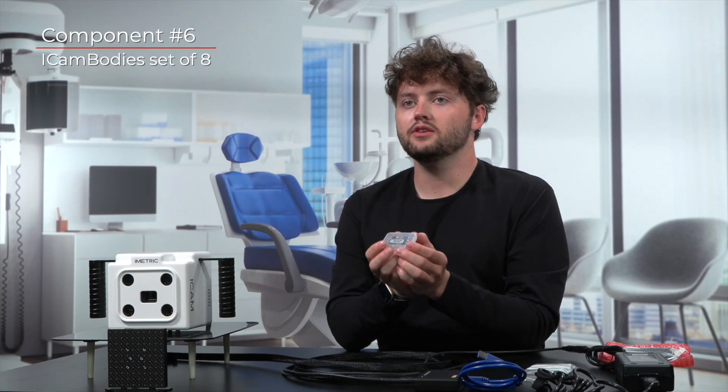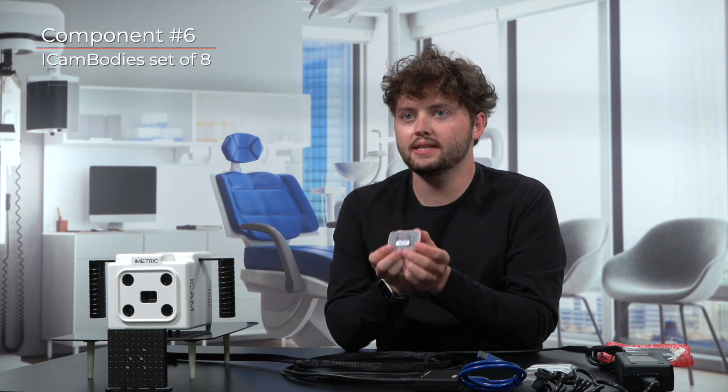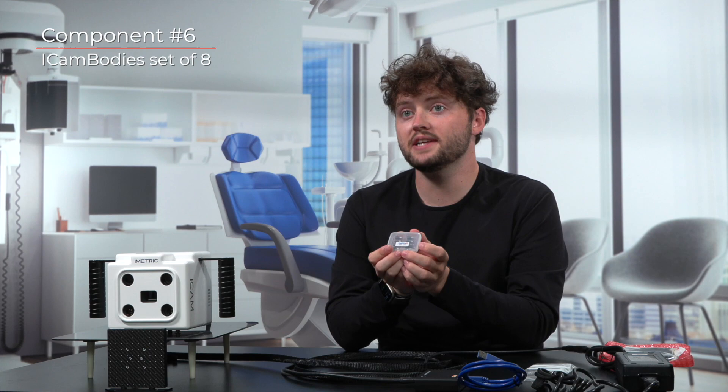Starting with the iCam bodies — these are the compact, domino-like scan bodies that will be attaching to your MUAs. These iCam bodies can be found neatly packed in a transparent plastic container. This container will display a label reading iMetric 4D, followed by an eight-digit serial number. It's essential to cross-check and match these serial numbers on the container with those listed on your DN shipping sheet.